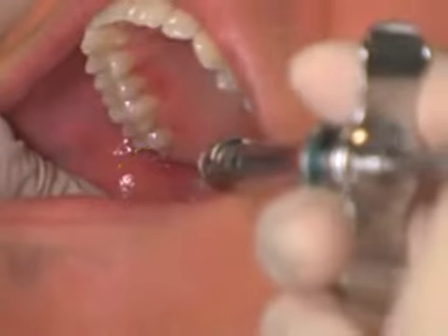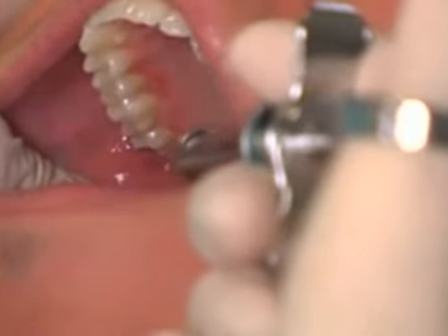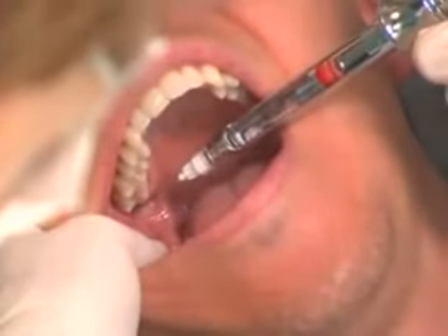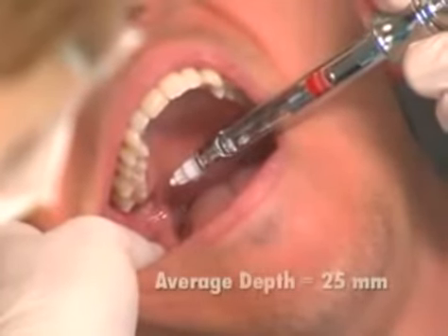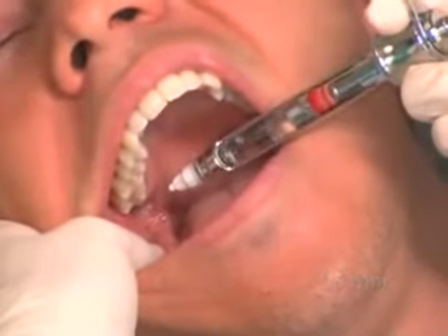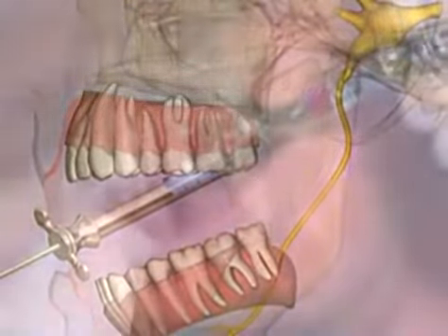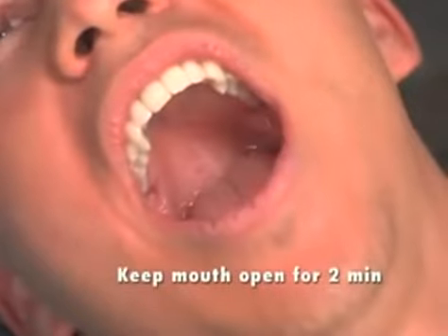And then the needle tip is moved just distal to the second molar. This locates the insertion site for the Gow-Gates injection. The needle is now inserted until bone is contacted. The average depth of penetration in the Gow-Gates injection is approximately 25 millimeters. After negative aspiration, 1.8 mL of anesthetic is slowly administered. Following withdrawal of the syringe, the patient is asked to keep their mouth open for 2 minutes.